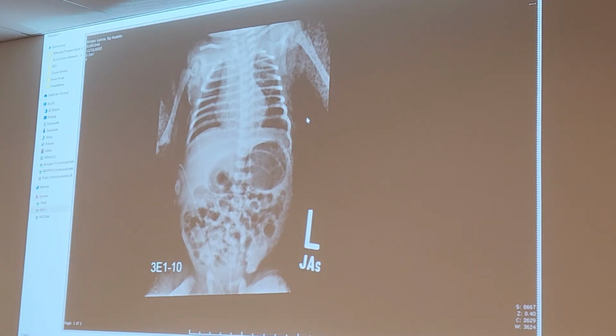What kind of equipment did we use for this X-ray? A portable. Is your portable using the CR cassette? No, you have digital portables, right? You don't need to worry about your CR cassettes. So, S value only goes to CR cassettes. It only goes to Fujifilm.